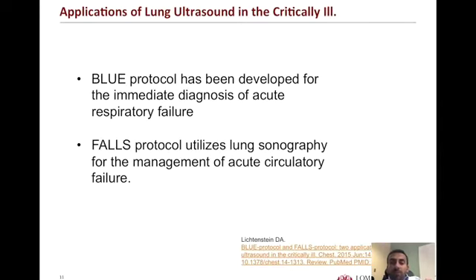There are many protocols when it comes to lung ultrasound, and this is actually a very complex topic. The goal of this module is simply to provide a very basic overview of the concept of B lines, which is a marker of poor aeration of the lung parenchyma. And the more vertical lines you have, extending throughout the ultrasound image beyond 10 centimeters, which again is what a B line is, the worse the patient's status is regarding their pulmonary aeration. But again, there are many protocols that discuss this topic in much greater detail.